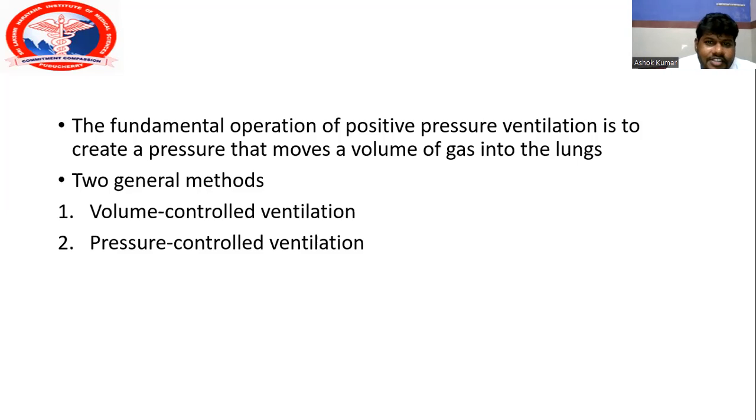Okay, I will tell about that. Positive pressure ventilation is nothing but creation of pressure that moves a volume of gas into the lungs. Most commonly, there are two general methods: volume control ventilation as well as pressure control ventilation. You can proceed to the next slide.